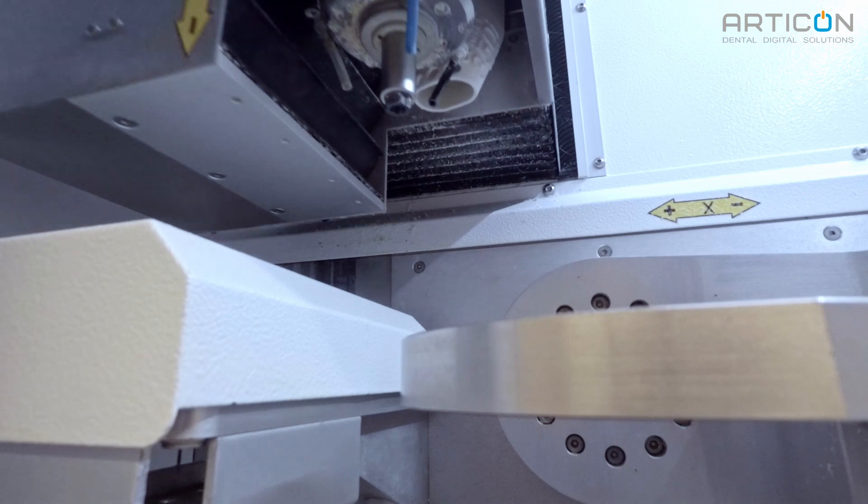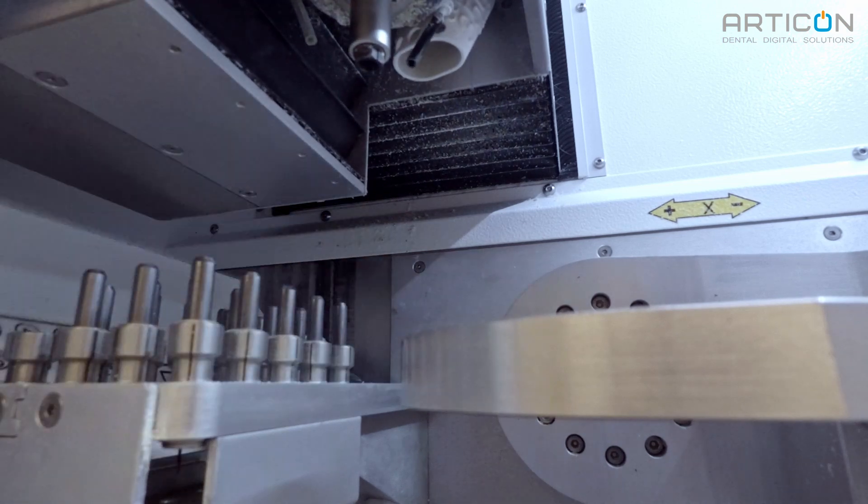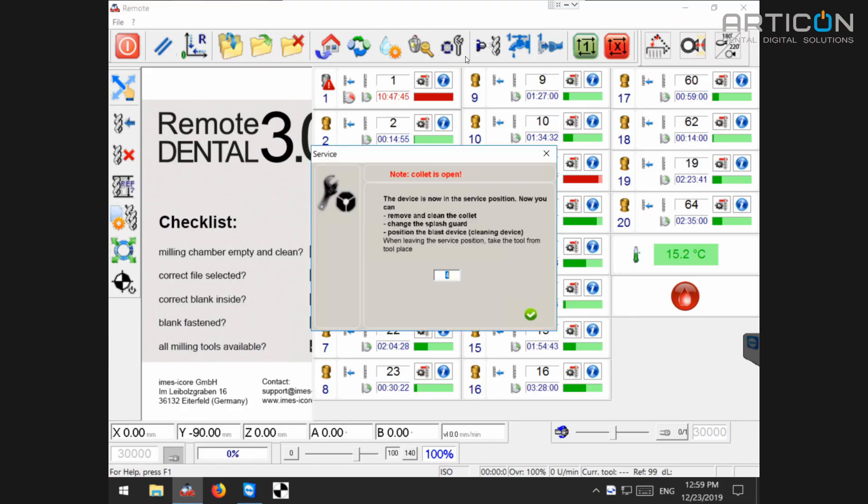The collet now is open and you can see a dialog window appeared on the screen. We will get back to this window later.